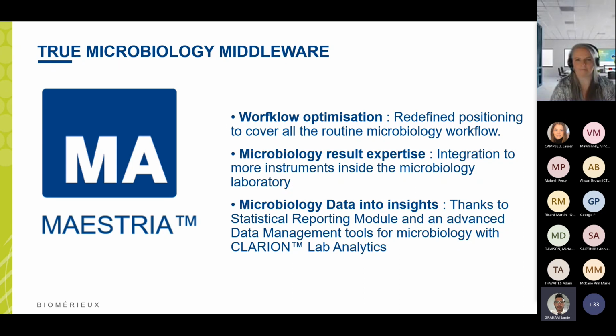We've got microbiology results expertise because we've got integration to more instruments and methods. We've got consolidated microbiology results, bringing customized expertise on all lab methods. And this should bring better patient care. So it's effectively an extra pair of expert hands in the lab.